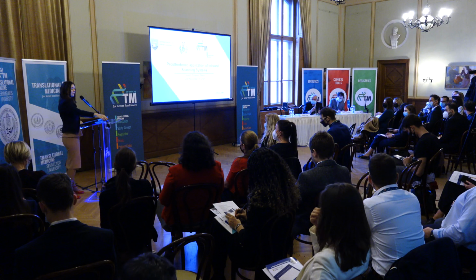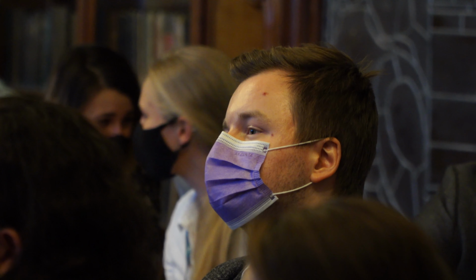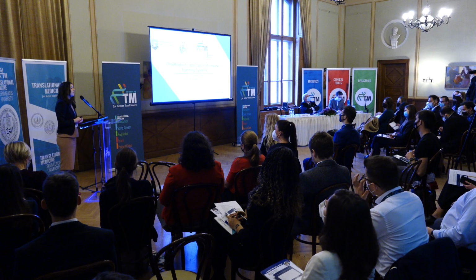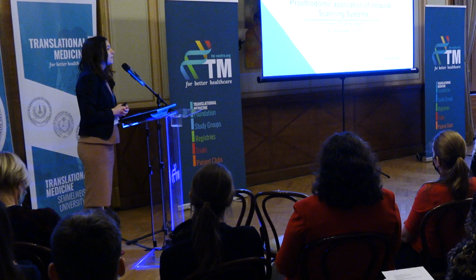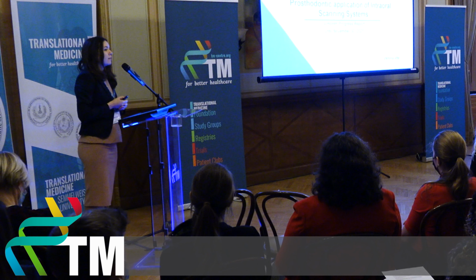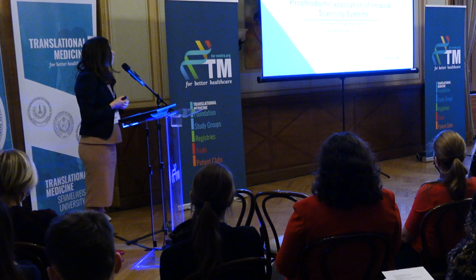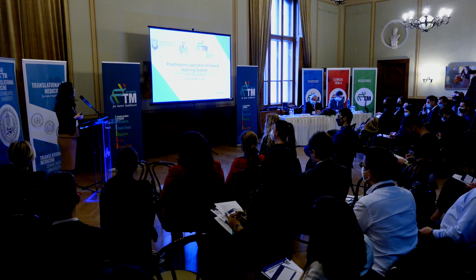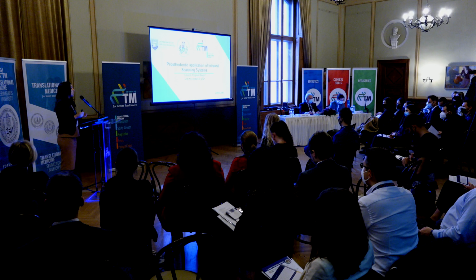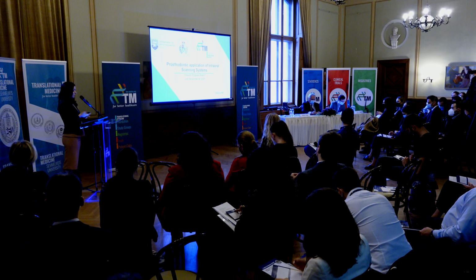Dear audience, last but not least from the dentist, let me introduce my PhD topic, which is connected to novel devices in digital dentistry, which are intraoral scanning systems. Intraoral scanners are used for impression taking from the oral cavity, but they are not just impression making machines, they also have some additional features which can be used in everyday dental practice.